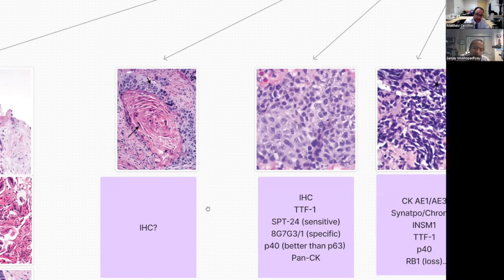So the only useful staining situation there is P40 positive, GATA3 negative. The rest, I think there's way too much overlap to be 100% certain. And you're just doing that in cases where patients have a history of urothelial carcinoma. Yeah, otherwise, why would you do a GATA3 in a clear-cut squamous cell carcinoma of the lung?